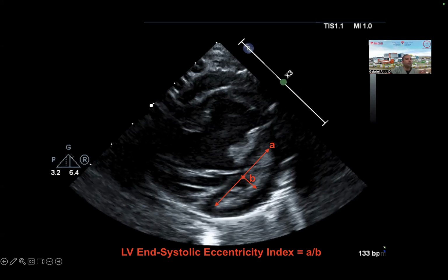Sometimes you can ask the machine to use the lower frequencies to get either general or more penetration. So you're going to see me sometimes tweak your images. If you're having difficulty on the 12S, I might turn it to general or penetration so that the machine uses the lower frequency of the probe to get less resolution but go deeper. So that's what this marker is telling you, the range of the frequency.